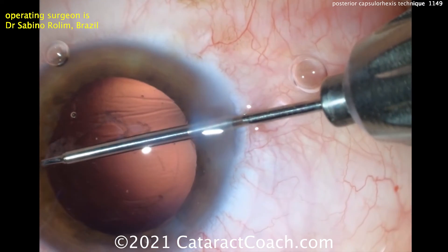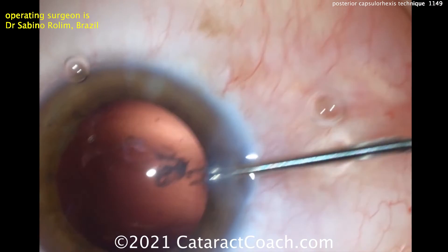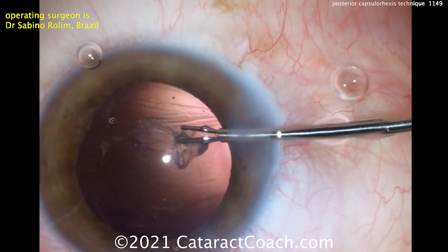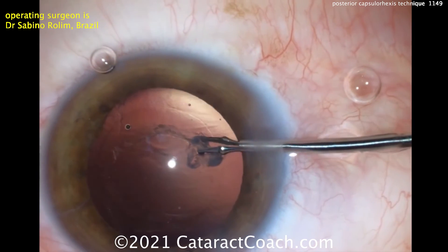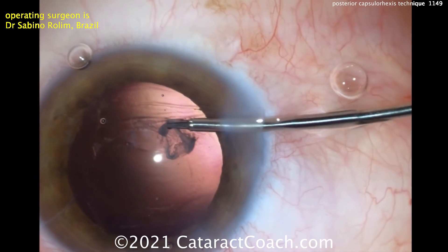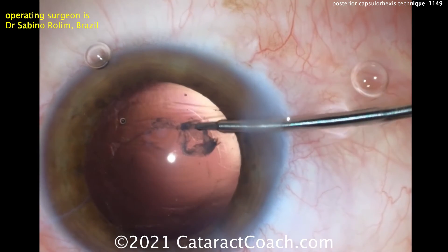Look at that — that is just beautiful. When you're doing this, adjust your microscope settings to highlight the red reflex to give a little bit better contrast and visibility. Almost done finishing it up. You can see the anterior capsular rhexis is about five millimeters, and this posterior rhexis looks like it's going to be about four — so that's just about perfect.